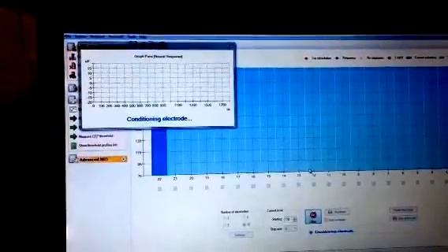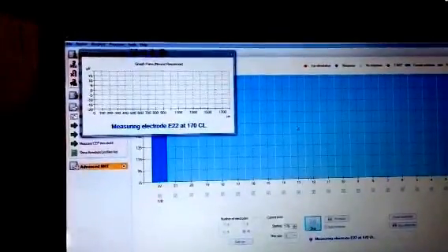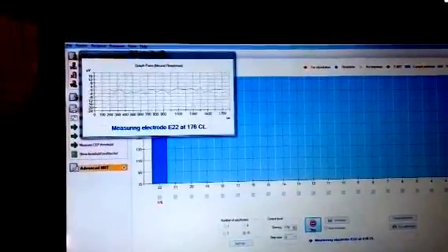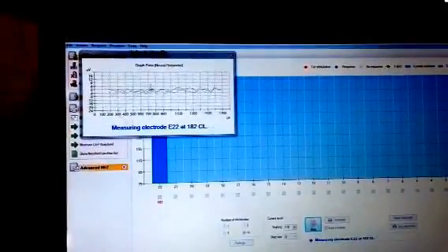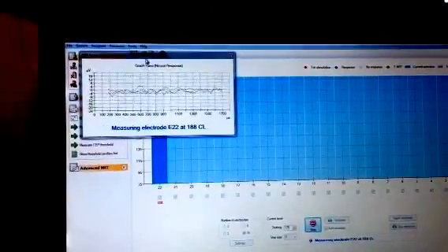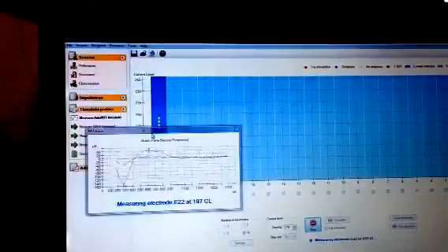Here you will see your N1 MP1 graph. There you can see a response. And below it will show you at what level is the NRT observed.